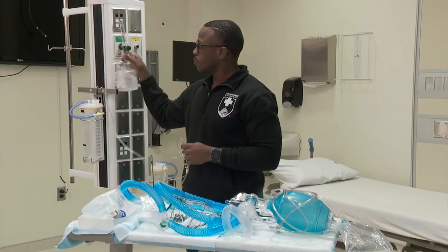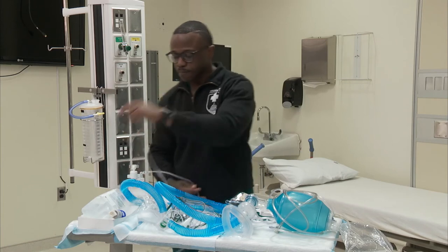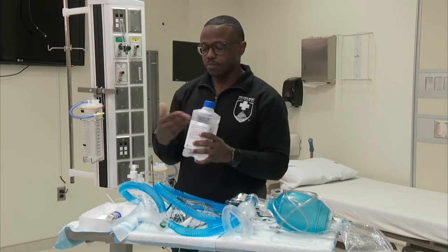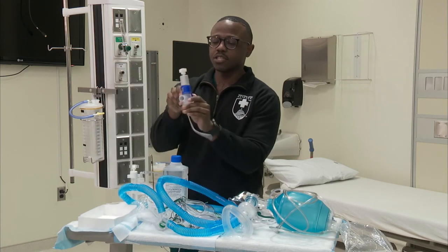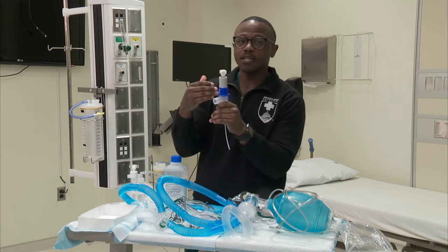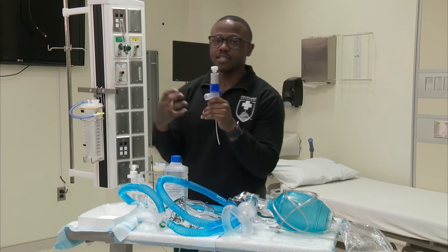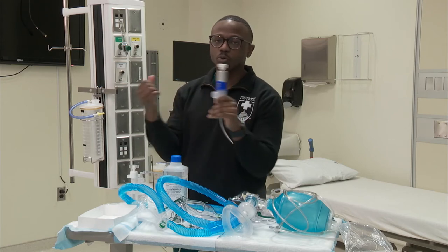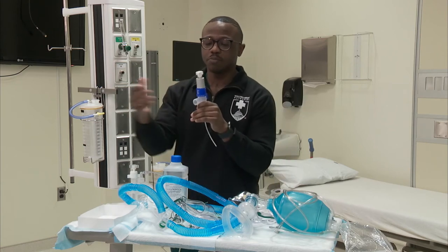Another oxygen delivery we have is what we call aerosol therapies. We have this bottle with a jet nebulizer. It has a blue dial and ports inside that allow the flow meter to create a jet velocity to pull in room air and allow for more liters per minute of flow to reach the patient.